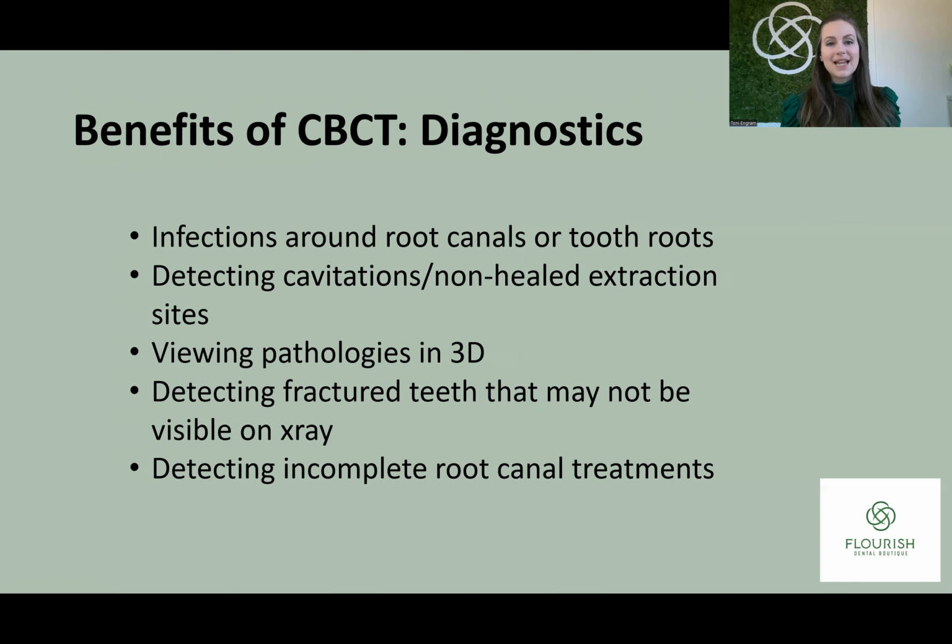We can also detect what some people refer to as cavitations, which are really just non-healed extraction sites, areas where the bone has not healed correctly after a tooth has been removed. This happens frequently in wisdom teeth sites. And we're able to see that and actually measure the bone density of an area, which is incredibly valuable.